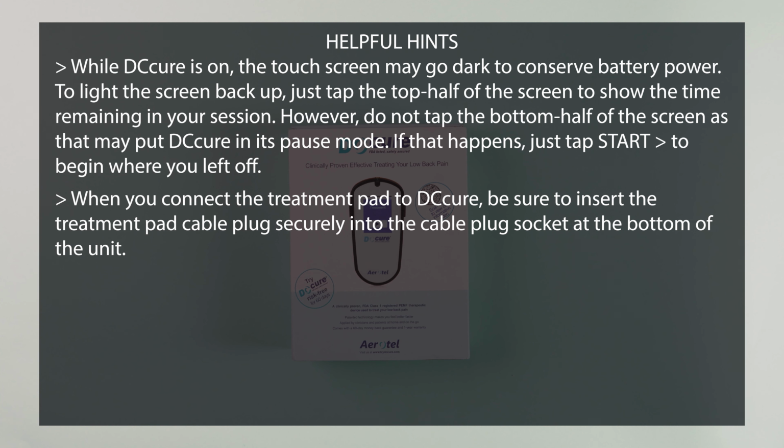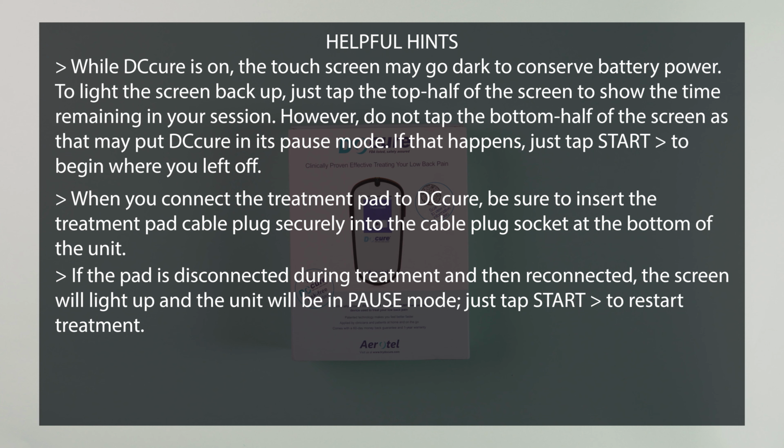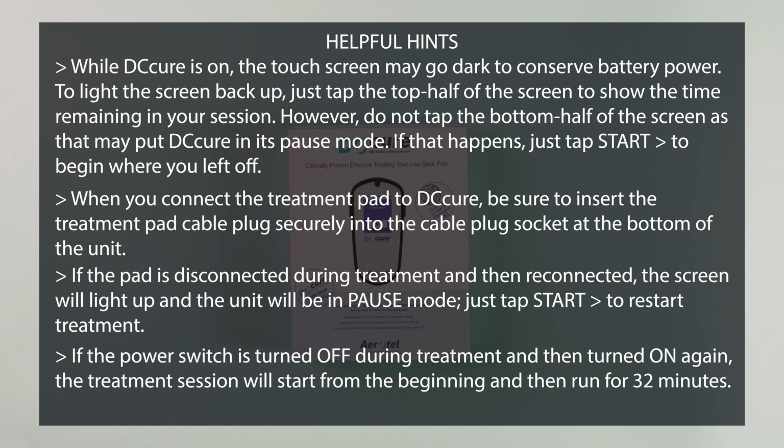When you connect the treatment pad to DC Cure, be sure to insert the treatment pad cable plug securely into the cable plug socket at the bottom of the unit. If the pad is disconnected during treatment and then reconnected, the screen will light up and the unit will be in pause mode. Just tap Start to restart treatment. If the power switch is turned off during treatment and then turned on again, the treatment session will start from the beginning and then run for 32 minutes.